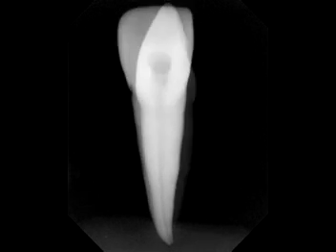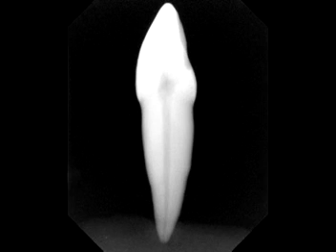In this case, we're using an upper central, and we're showing both views of the radiograph, a buccolingual and a mesial distal.